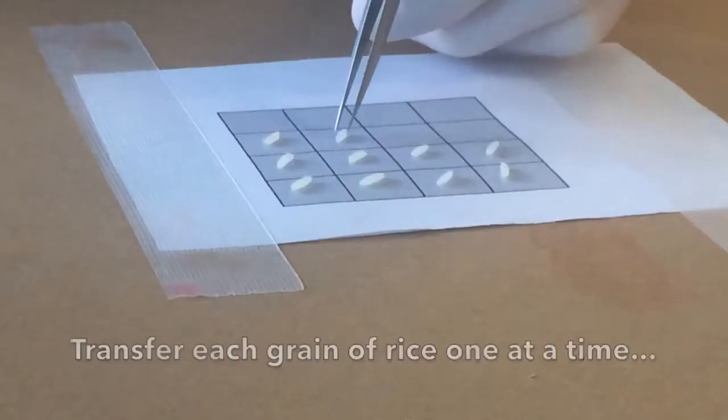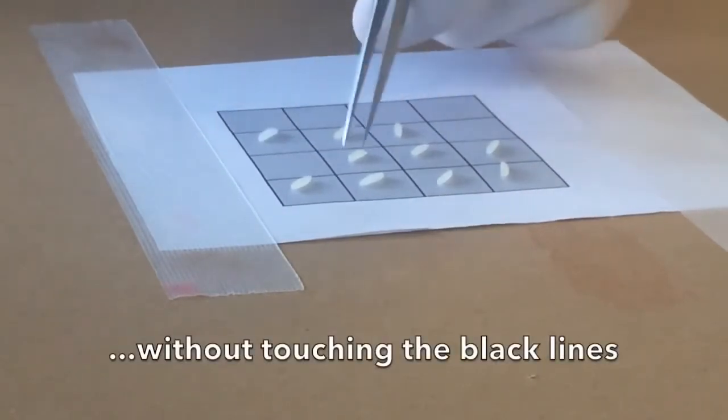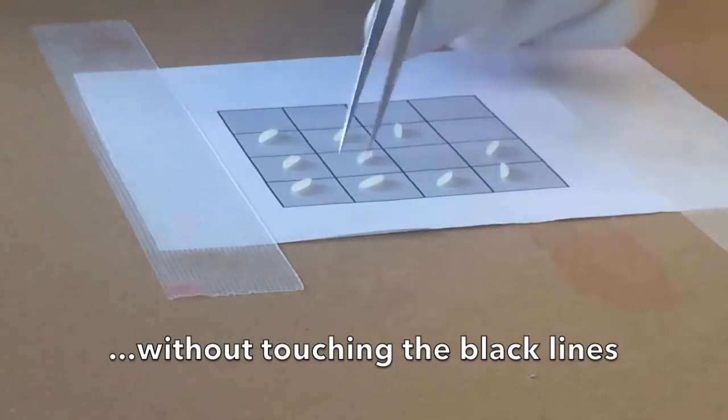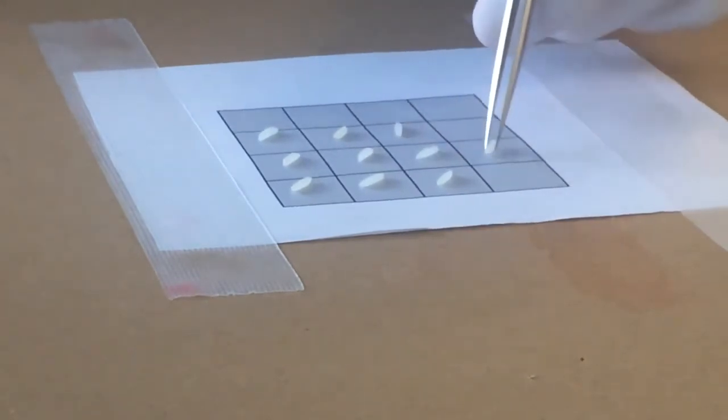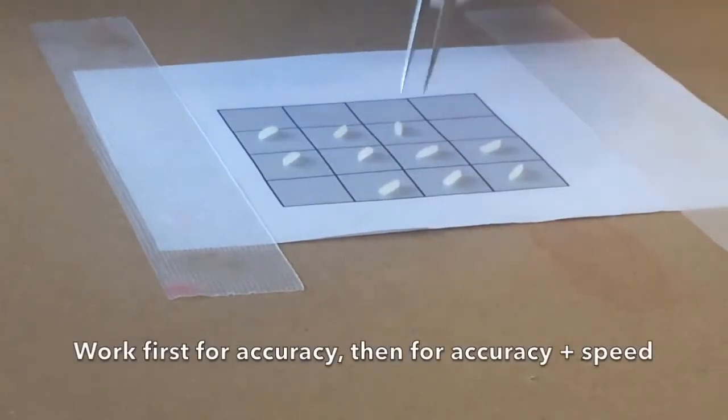The fifth model is the rice transfer exercise. Transfer each grain of rice one at a time without touching the black. This exercise tests dexterity with the micro forceps. As before, work first for accuracy then accuracy plus speed.